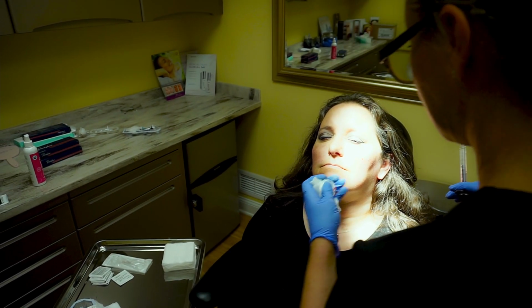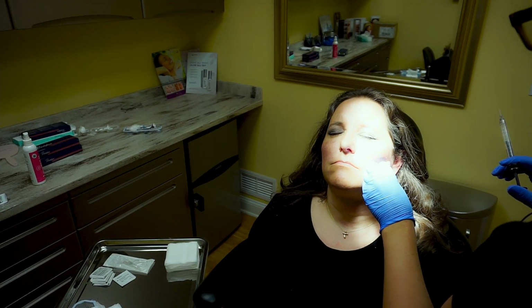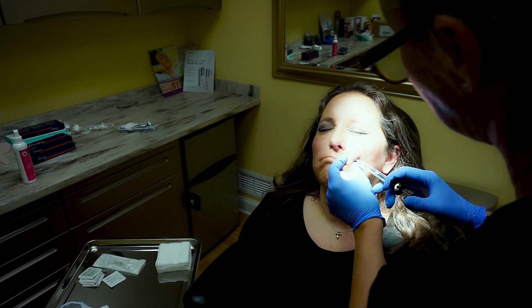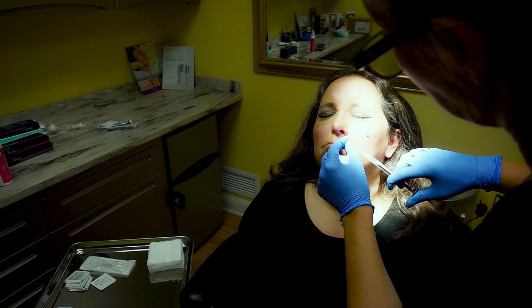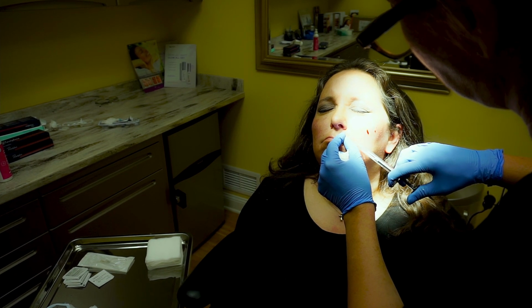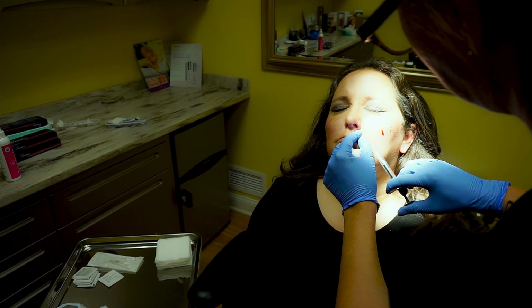So I'm just filling in the front, just rounding out what we call the OG curve of the cheek. So you want it to be rounded out in front, not only laterally, but anteriorly as well. And then the tricky thing is getting the balance and symmetry. I'm going to come up and just underneath the skin here. And fill in the nasolabial fold the best I can.